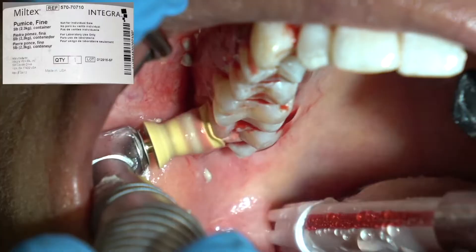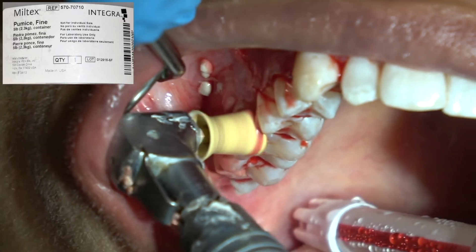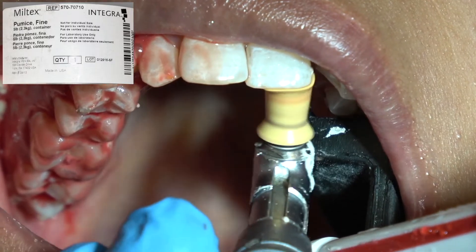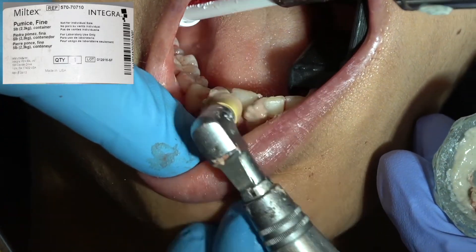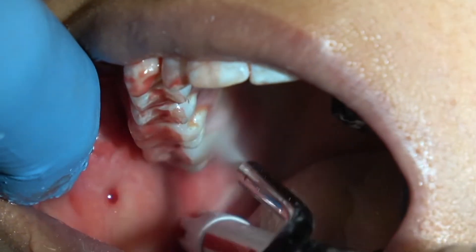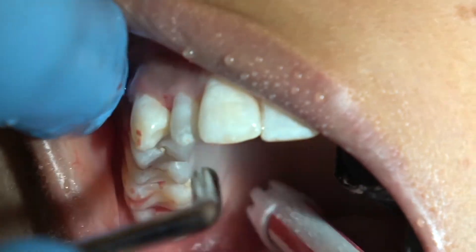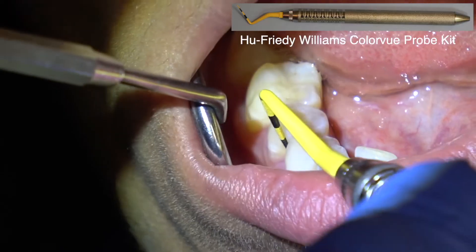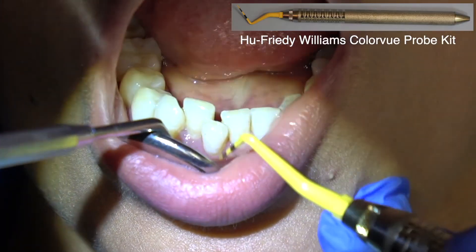If the patient continues with proper home care, especially the flossing, the gingival tissue will stop bleeding. I tell the patient their gums are going to bleed every time they floss and brush for about three days, and then they'll heal and the bleeding should stop. Once I've completed the gross debridement and flossed and polished them, I take some Perigard or chlorhexidine in a syringe and rinse between each tooth. They come back a week later to see the hygienist, who checks the probing depths and does fine scaling and polishing.